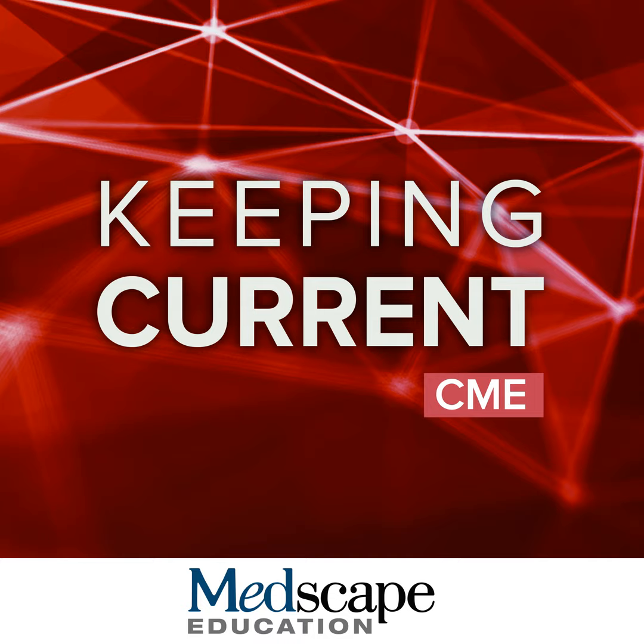So in the past, MRI was used, and other types of imaging actually, not just MRI, to try to rule out a structural cause to the dementia. For instance, a big frontal meningioma compressing the frontal lobe and explaining the patient's decline in cognitive status. Nowadays, there's been a regain in interest because there are new treatments available for patients with Alzheimer's and mild cognitive impairment.